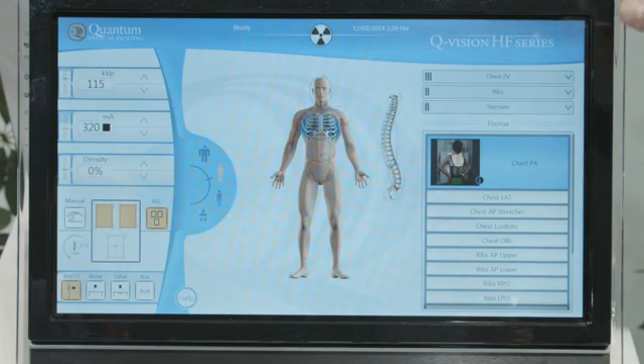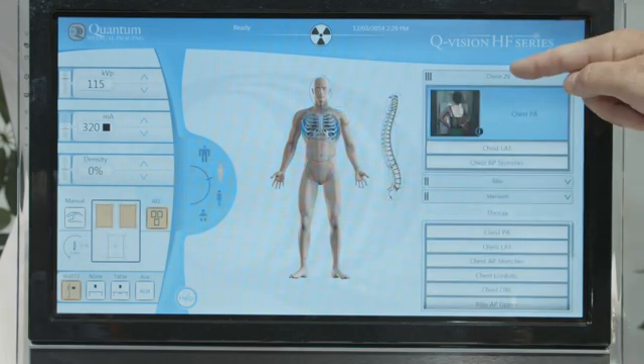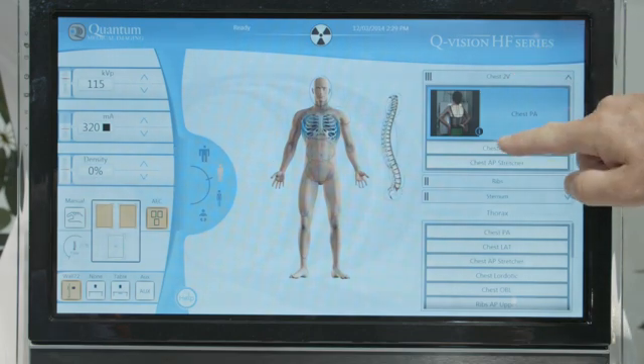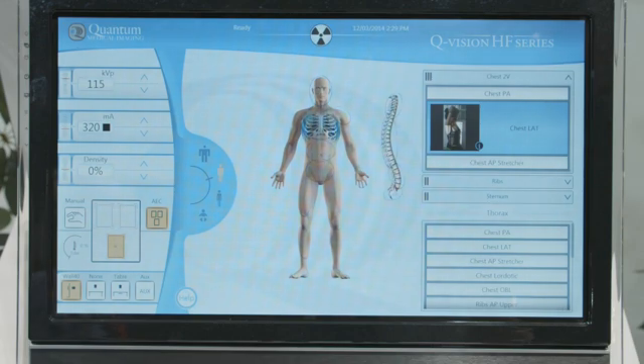With the QVision generator, we can also configure exposure groups, and in this case, a two-view chest. As we shoot, it will automatically sequence to the next view for the chest lateral, and also shows a positioning guide for operator assistance.